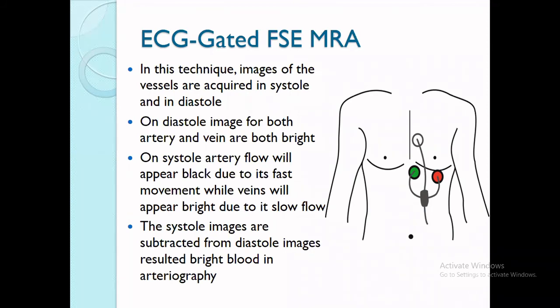But there is a particular phenomenon that is happening. For example, if you are using the ECG-gated FSE MRA, diastole is actually the relaxation of the chambers.